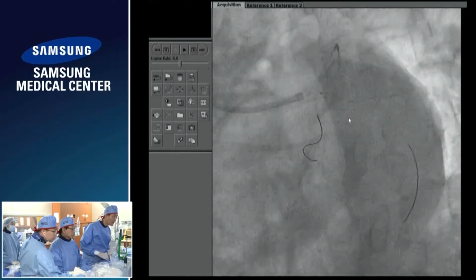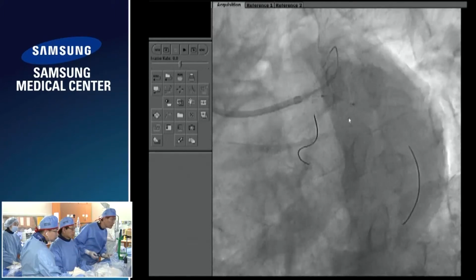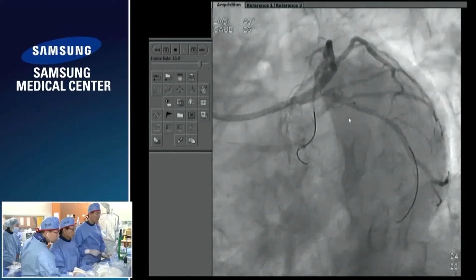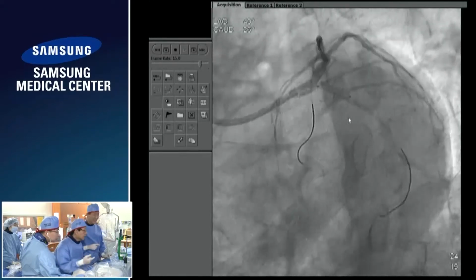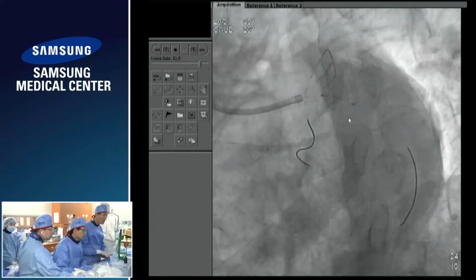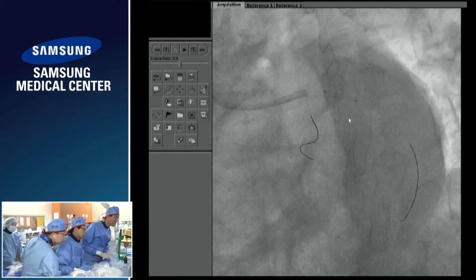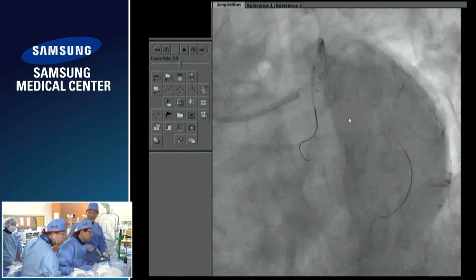Okay, I'd like to do the angiogram. Maybe we need more proximal. The middle of the balloon marker, the center marker, is okay at the edge, but for safety, a little bit more, so we cover the ostium. We haven't covered the carina yet. Yeah, I think it's okay.